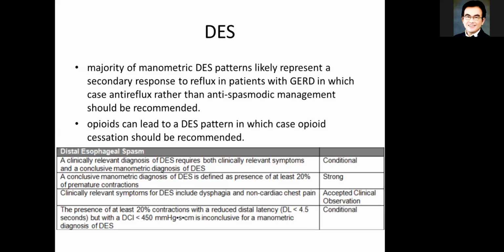I think another important point to take note of in our protocol is, of course, when you are doing a positioning change, supine to say upright, always bear in mind that the positioning will have an effect on your so-called Chicago matrix. So I would again encourage you to read on.